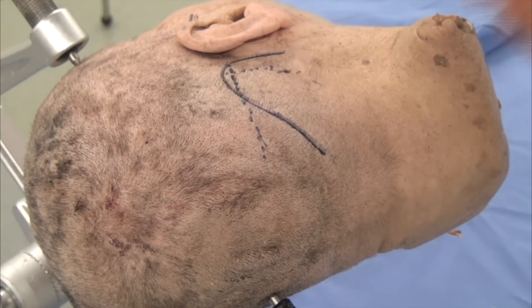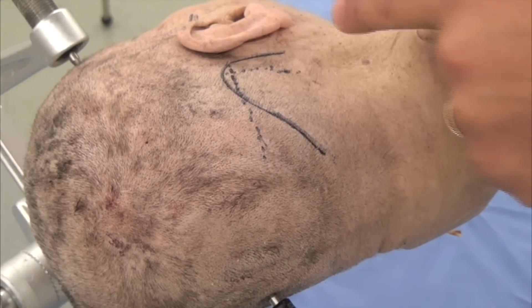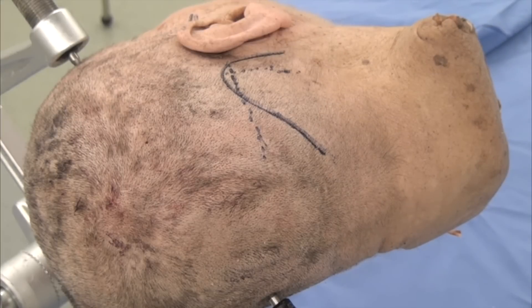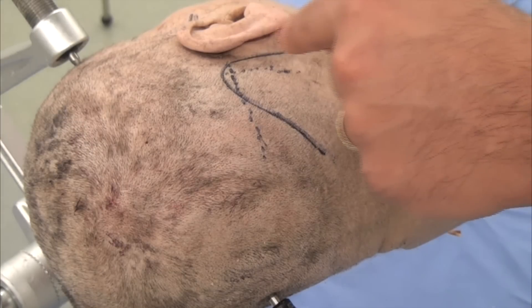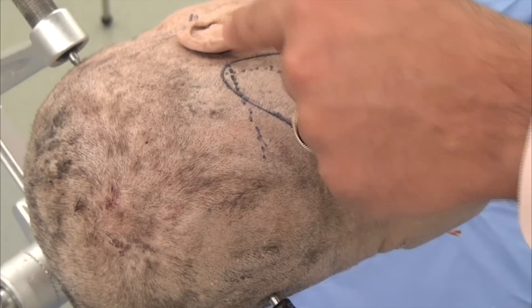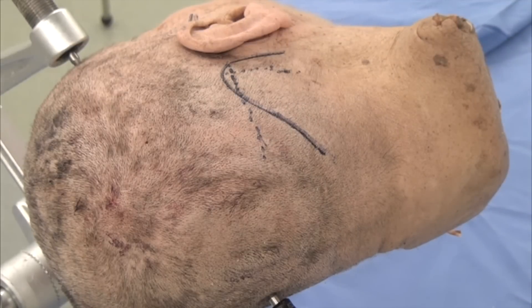Let's talk about how we place the incision so we can make sure we can reach and expose the junction of the transverse and sigmoid sinuses.